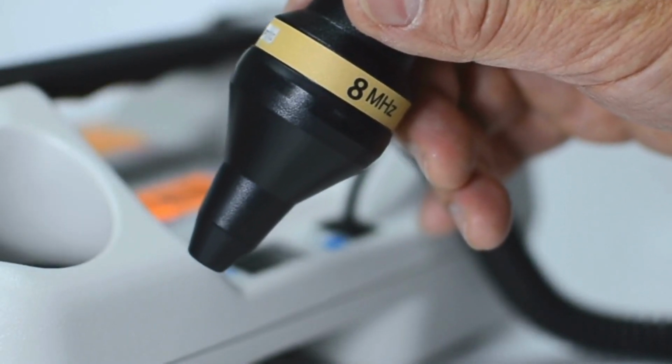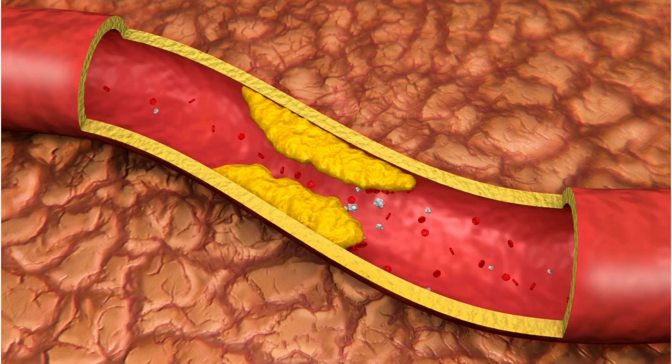Years ago, I saw a patient with a toe wound that looked off. Cool skin, purple tint, not infected, but not healing either. I pulled out the handheld Doppler, turned it on, placed the probe, and heard one long, weak swoosh. That's when I knew this wasn't just a wound. This was poor blood flow. And if we hadn't caught it, that toe could have been lost.